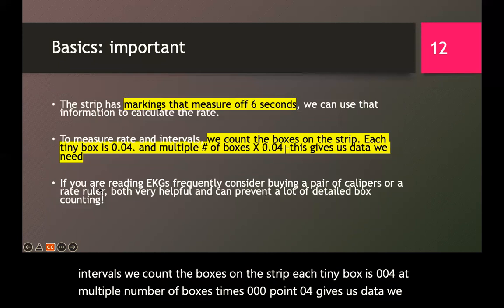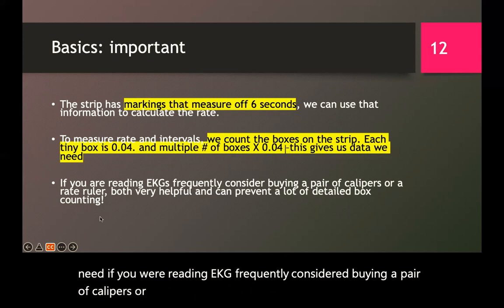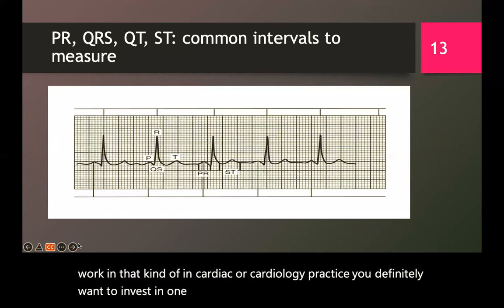If you are reading EKGs frequently, consider buying a pair of calipers or a rate ruler, which are both very helpful and can prevent a lot of detailed box counting. Yeah, for sure. If you work in cardiac or cardiology practice, you definitely want to invest in one of those for sure.